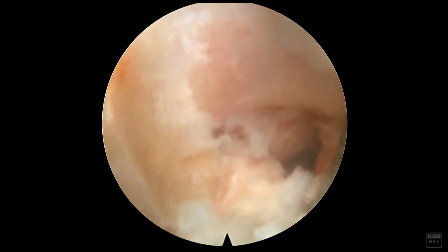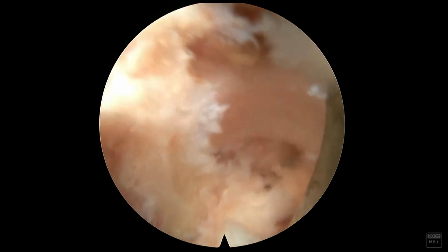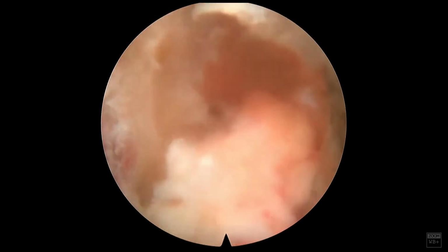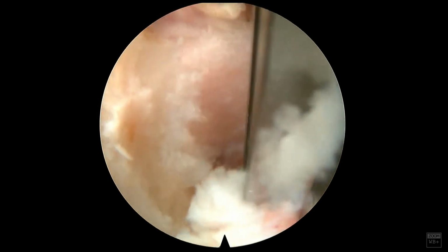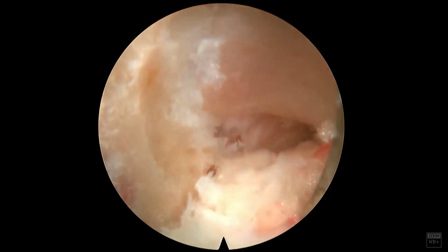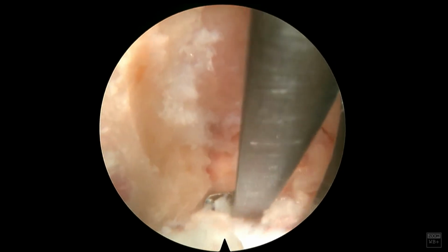So almost done with the burr work here. Again, you can see I've taken off a fair amount of the SAP, but not so much that it destabilizes anything. It's a little bit of experience on how you determine how much you need. I try to access a little bit of the disc space as well and make sure that the exiting nerve root is decompressed. So here I take the Kerrison, try to remove some of that ligamentum attachment from the SAP again, and remove any sharp edges.